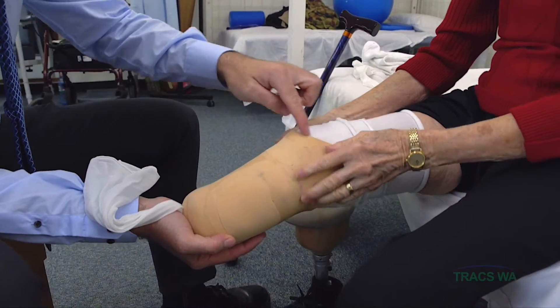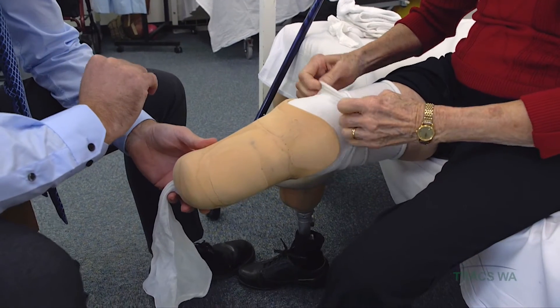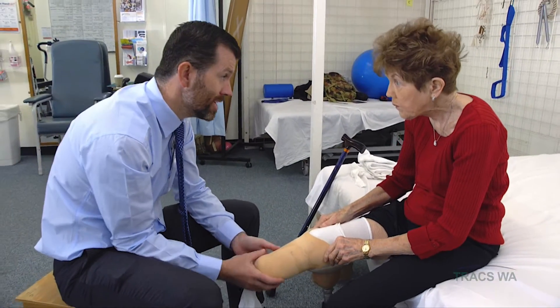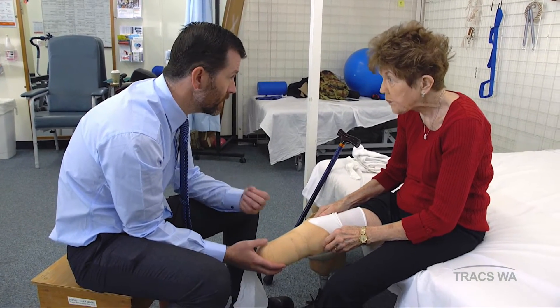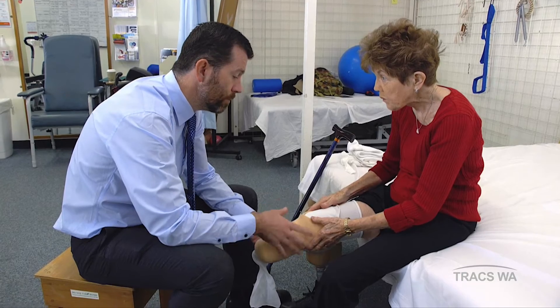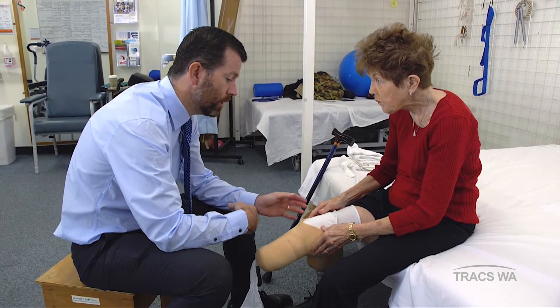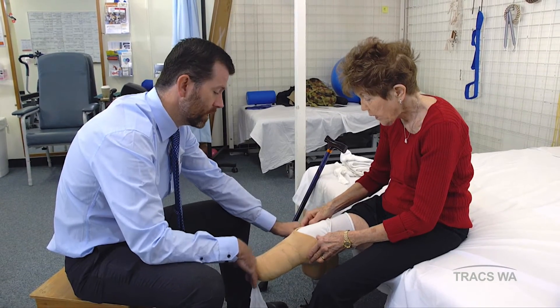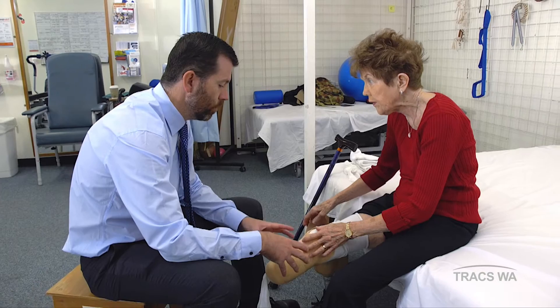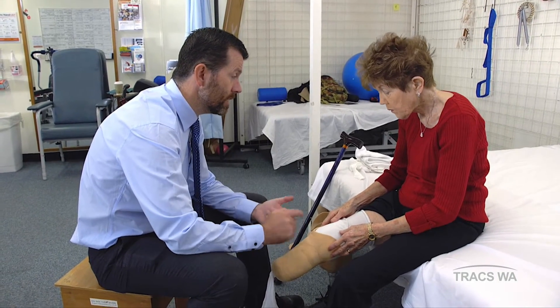Your kneecap just needs to drop into that little hollow that's allowed for your kneecap — that would be about the centre, marked by that little mark there. This nylon sock is designed to pull all of the soft tissues and the socks down into the socket so that it doesn't plug and get stuck going in. This helps us get it in, especially as it gets a little bit tighter. It's really important that this liner is sitting where it's designed to be. All the lumps and bumps need to be in the right spot so that we're putting weight where we'd like on your leg, protecting the spots we want to protect, and ensuring the prosthesis is the right length.